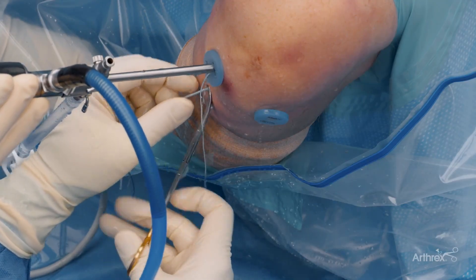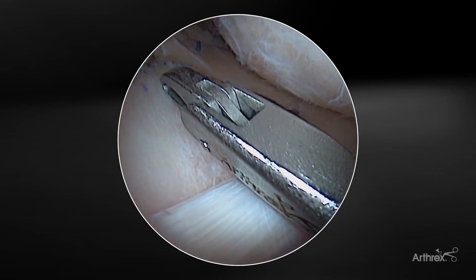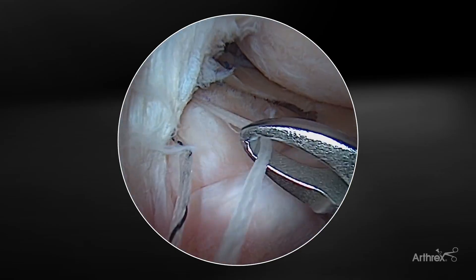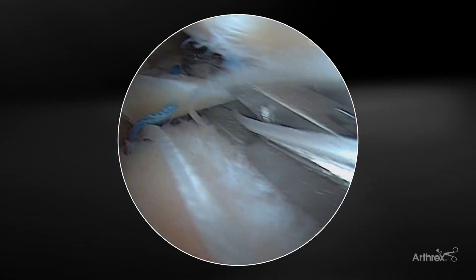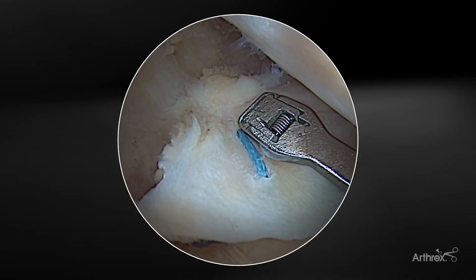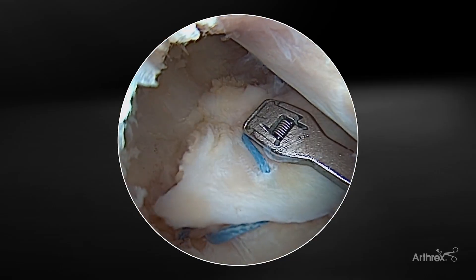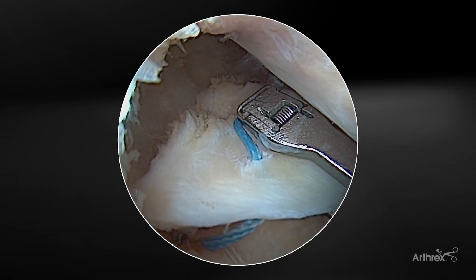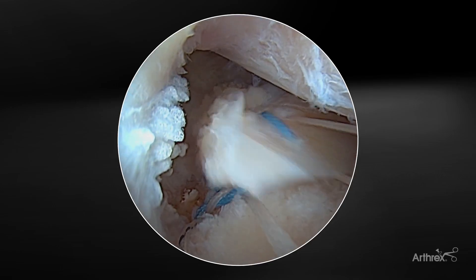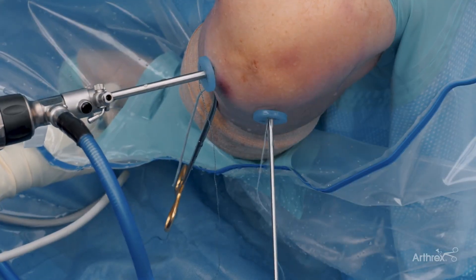We're going to reclamp the sheath coming out of the tibia with the hemostat so we don't inadvertently deploy it. We're now going to do the horizontal suture, which entails just one pass. The key here is to come just off the edge of the vertical repair suture. Slide it over and look where that prior suture is so we get a good Mason-Allen configuration. You can see the suture really nicely and we're going to be just off axis so this will be a nice horizontal suture. Twist just a little bit with the scorpion so that you don't run into the condyle, and slowly squeeze the needle to deploy the suture.